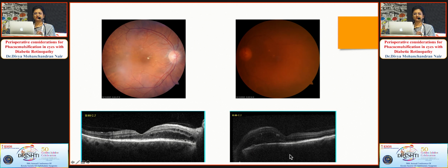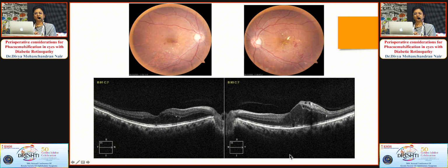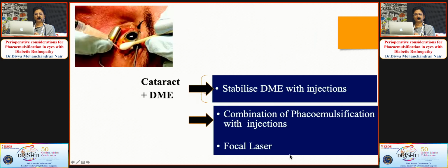So this is just an example of a patient who had come to us and was posted for cataract surgery elsewhere. In the left eye, as we can see, there are few hard exudate lesions close to the fovea, and SD-OCT clearly tells us that there is intraretinal edema, there is a small PED and some subretinal fluid. Even though it is not clear, we have enough clue to counsel and tell the patient what is going to happen post-operatively. So this is another patient, both eyes pseudophakic and has developed diabetic macular edema, and the left eye is a recent post-op where there is severe diabetic macular edema.